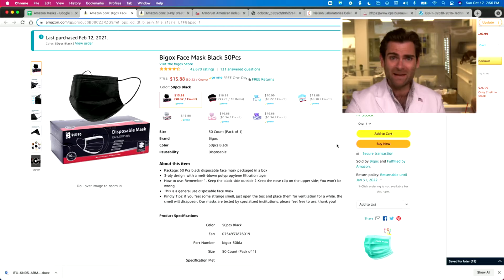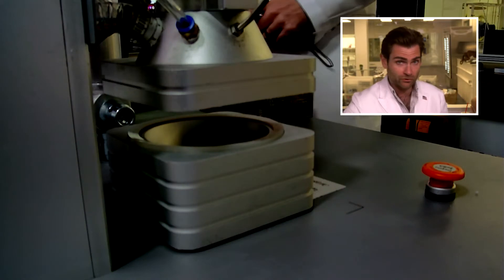Hey everyone, welcome back — we are testing every single mask on Amazon. I told you I test them all, especially for you Timmy. We are testing the Big Ox face mask, let's get in the clamper and we'll talk some more.